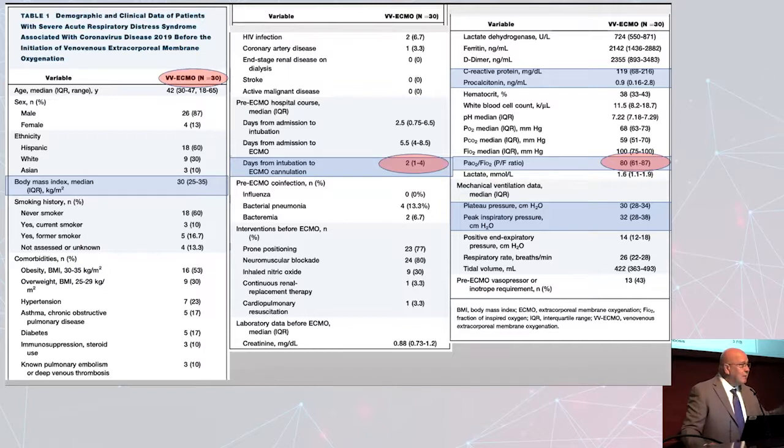Do you have a recoverable disease? Putting people on ECMO, if you aren't going to transplant, you have to recover because you cannot stay on ECMO forever. Though there are some who have been on ECMO for a very long time and actually survived. So you have to remember there's outliers, but then there's also everyone else. Who's the outlier? No one really knows.